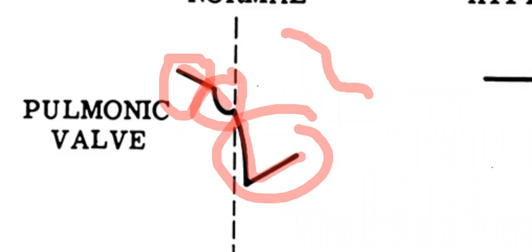So the pulmonary valve is bulging forward. When it opens, it doesn't open strongly because it's already held upward. So the distance that it goes after opening is not as much as during expiration, when the flow is low and the valve is straight and has to go a long way into opening. During inspiration it's bulging and curved because of the effect of the flow, and it has to go a short distance. That makes the murmur soft during inspiration. Here it's the same: the influence of the atrial contraction causes bulging of this valve.